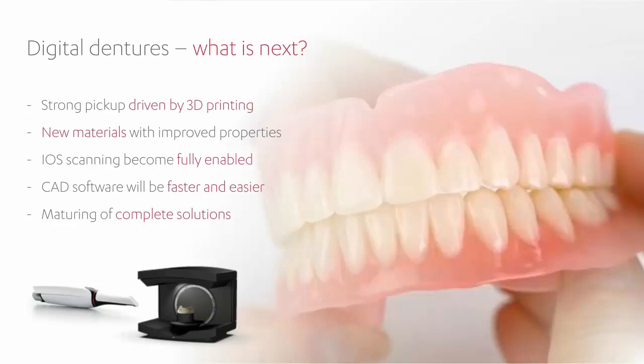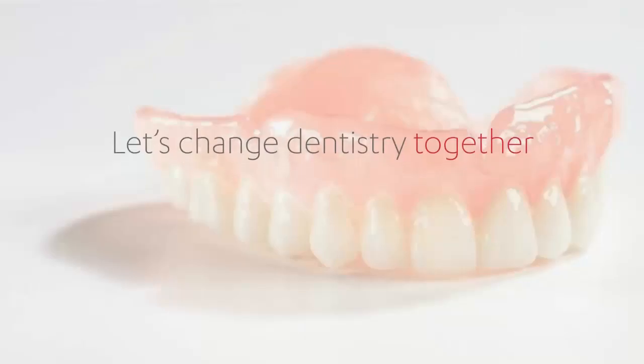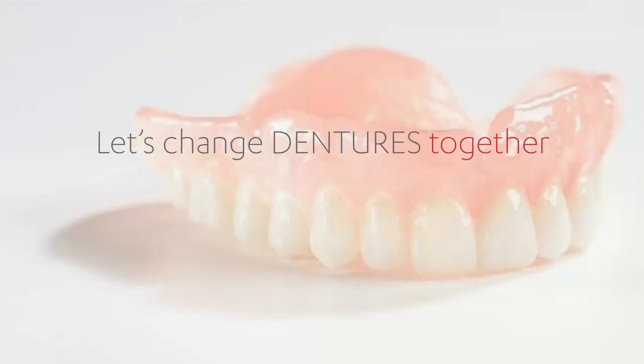You can do immediate dentures, partial dentures, base plates, copy dentures, and the CAD software will be faster and easier. We see a lot of maturing of the complete solution. So let's change dentures together is normally our slogan.